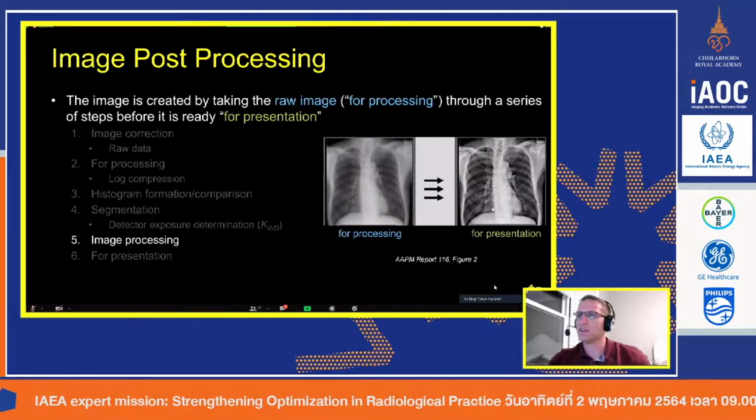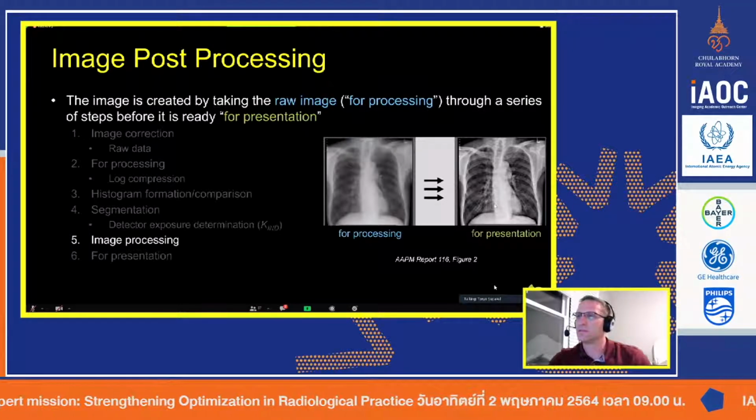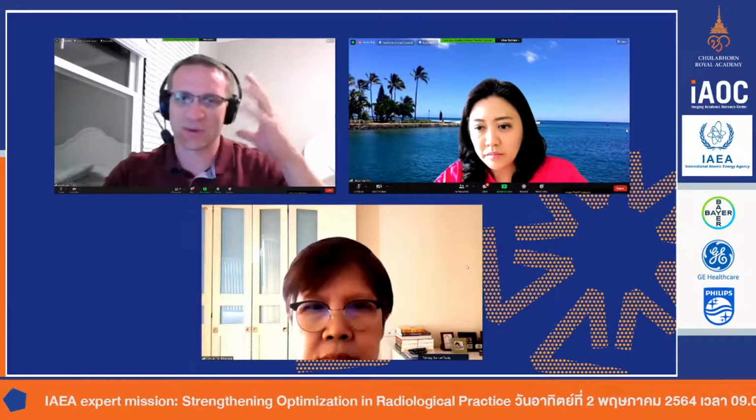And so another question is, does it mean we need to use a grid in almost every body part? Or it depends, because I know that for children, sometimes we don't use it in the fluoroscopy, right? But for the radiograph. Yeah, that's a great question. And I didn't really focus on that. I probably should have put one slide on that since I was thinking more COVID, which we'll talk about in a moment. But in chest and abdomen, yes.